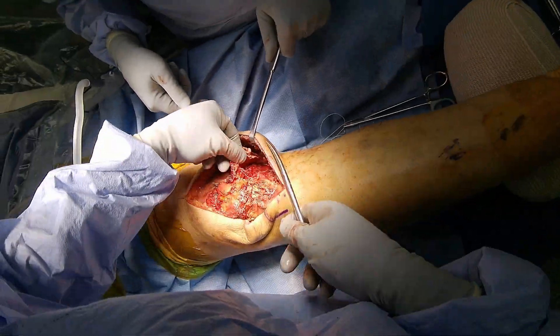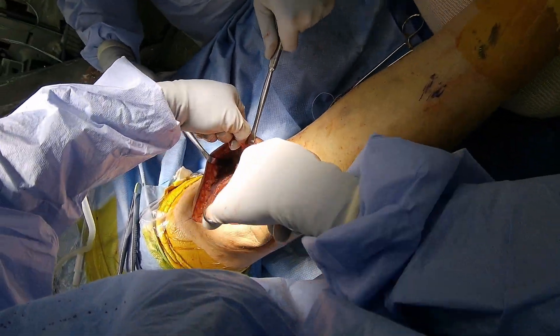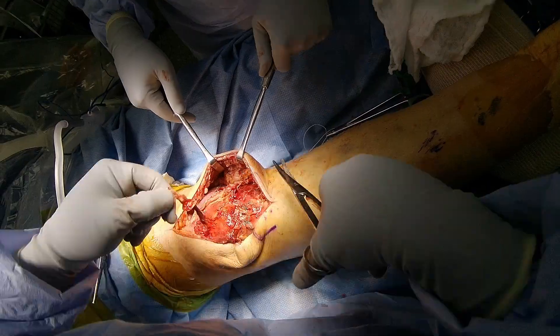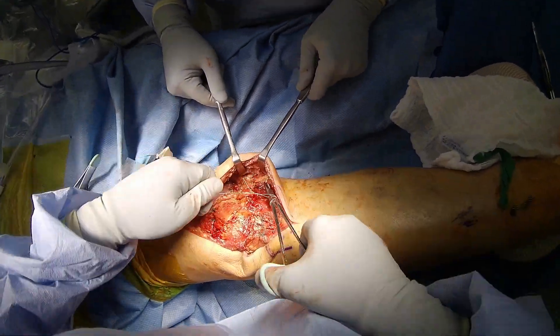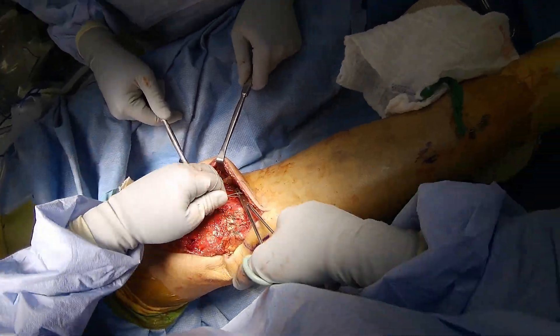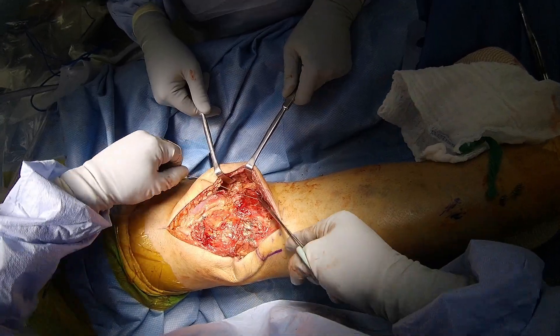It is now time to repair the retinaculum. There is substantial overlap of the tissues now which is good. It allows me the safety of cutting some redundant tissue that looks unhealthy and still have enough overlap of healthy tissue. I repair the retinaculum with a large vicryl suture such as a number one. I do the repair in a running technique, one half then the other half.